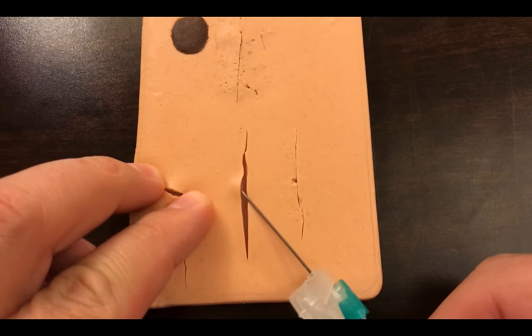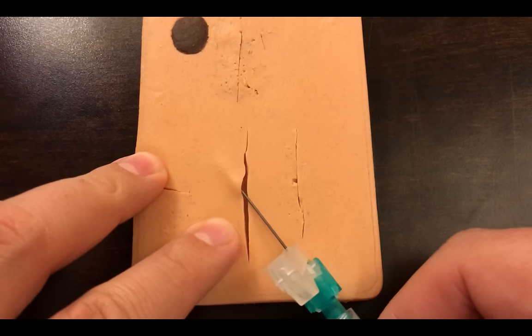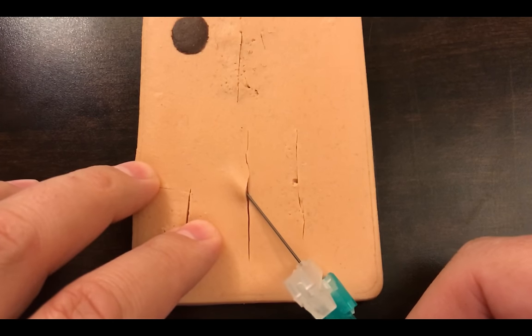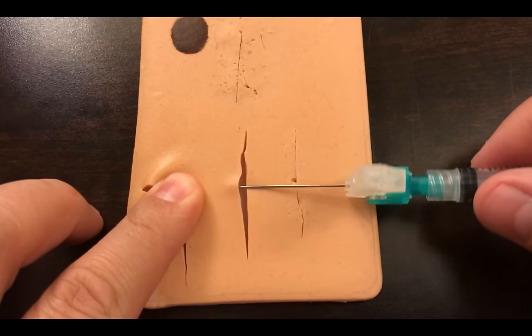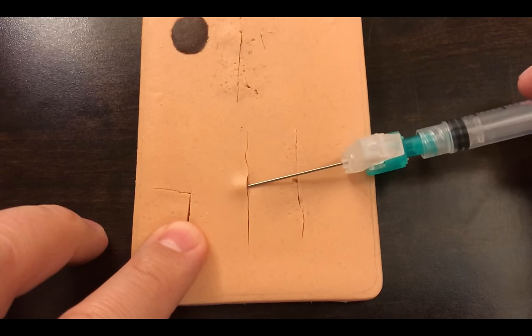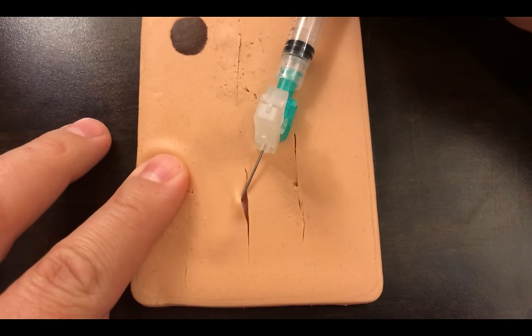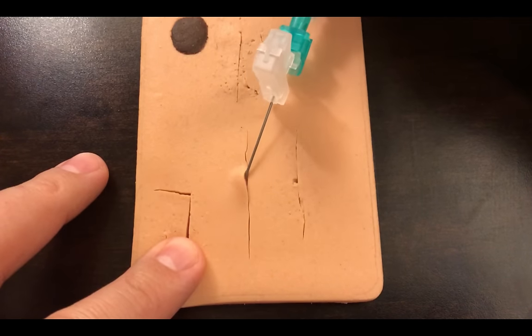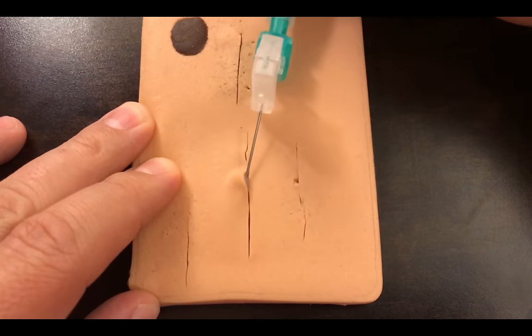Notice I pulled back but didn't pull all the way out — the bevel of the needle is still buried. I reposition and advance the needle again, aspirate just a little, then inject as I withdraw. I'm fanning out a little, injecting more as I come out, doing a fan-type positioning from one spot. My needle has only penetrated the tissue in one location so far, thereby minimizing damage to the tissue, and I can inject all along this side from one hole.